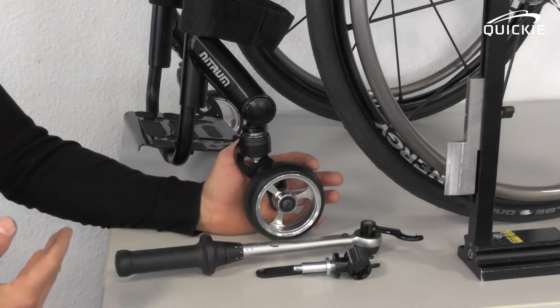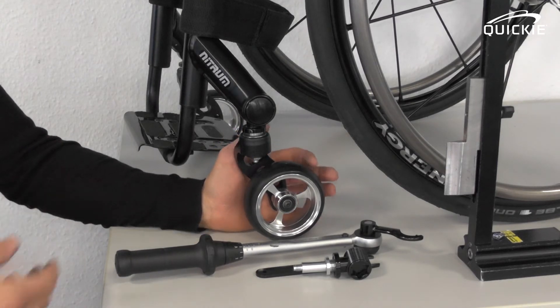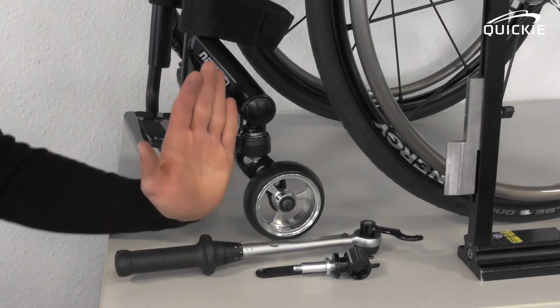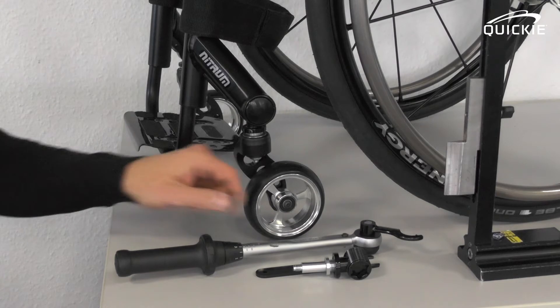Now you have adjusted the height of the caster wheel correctly. You will now have to conduct a second procedure, which is the lateral angle of the caster fork.